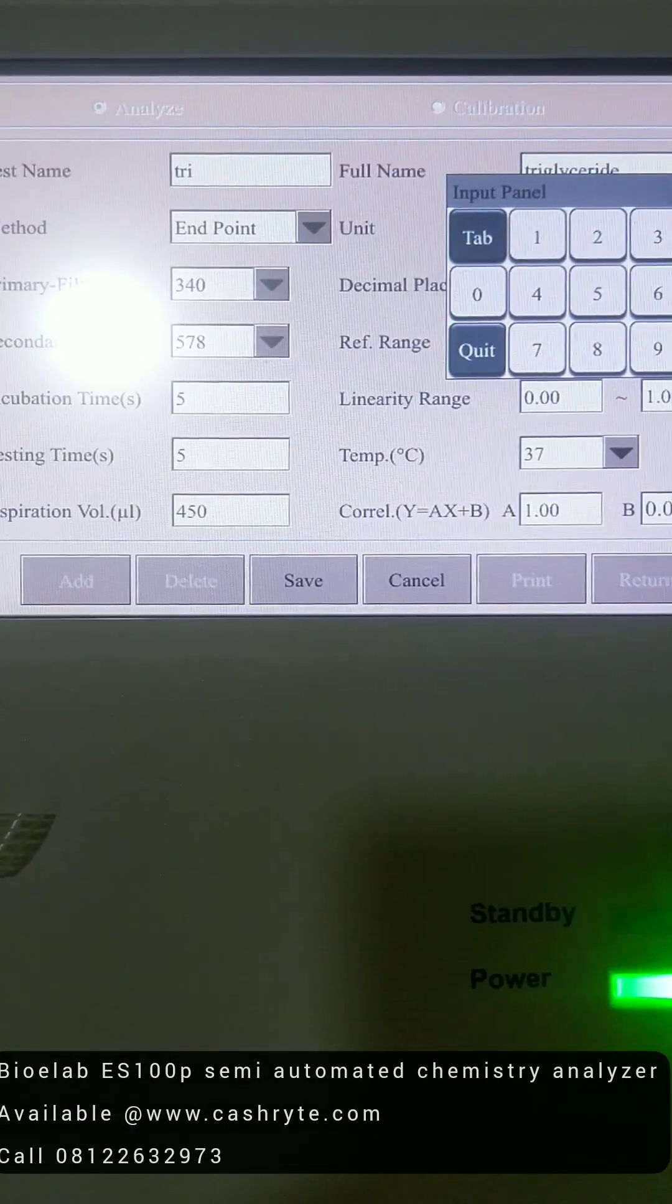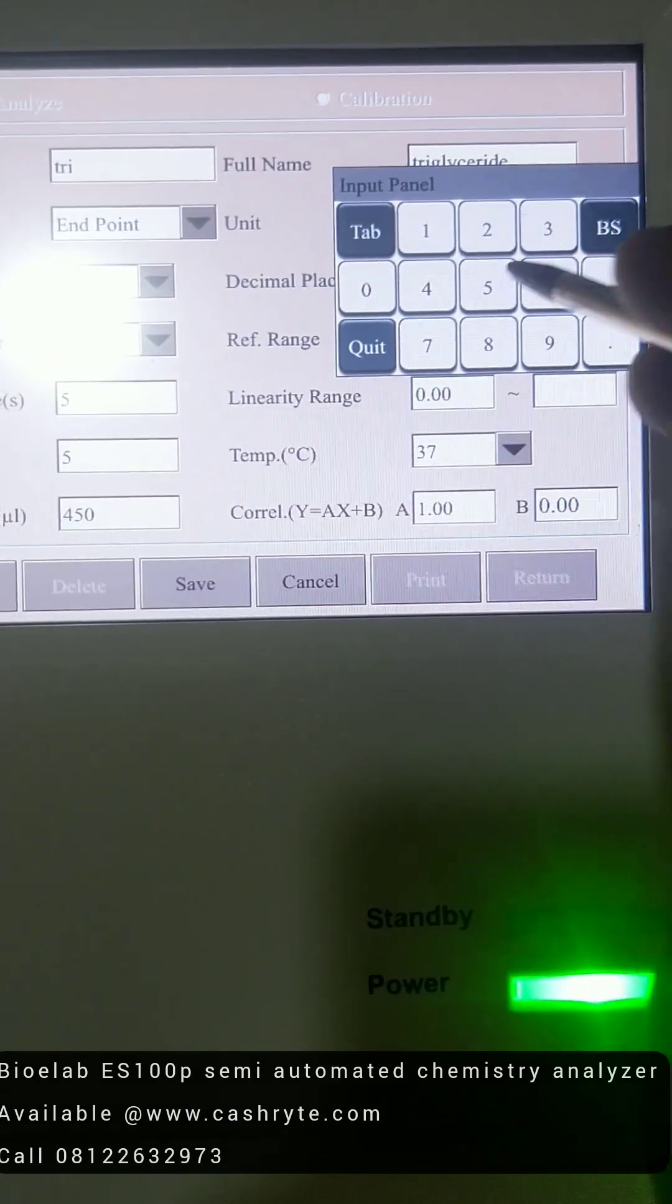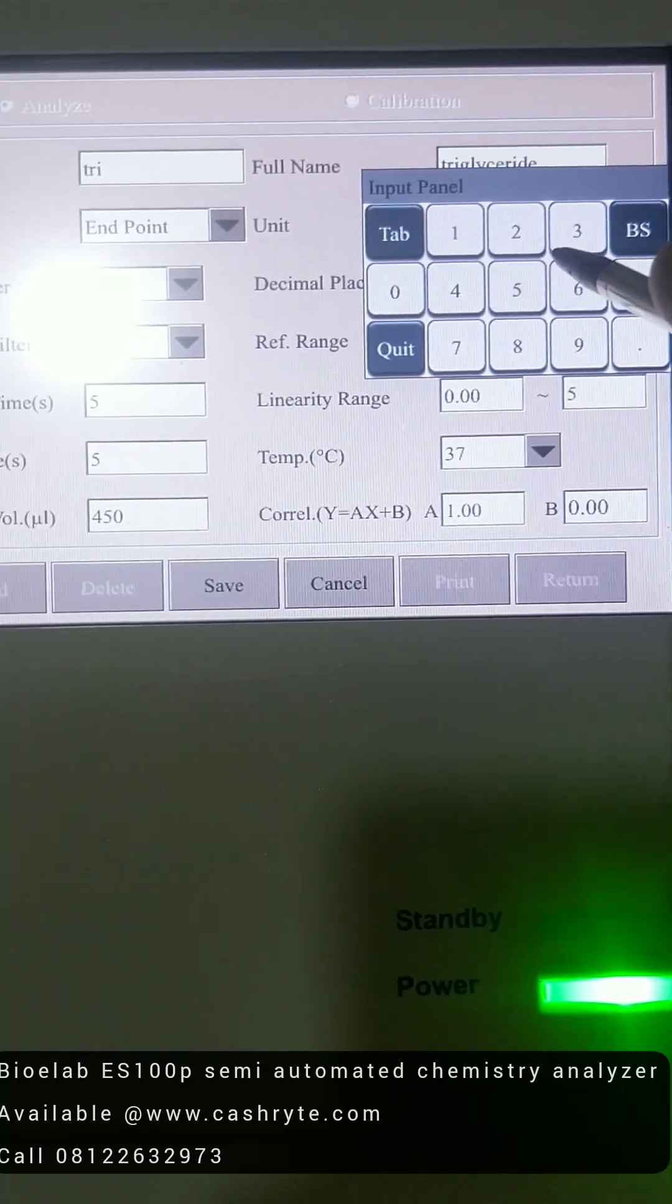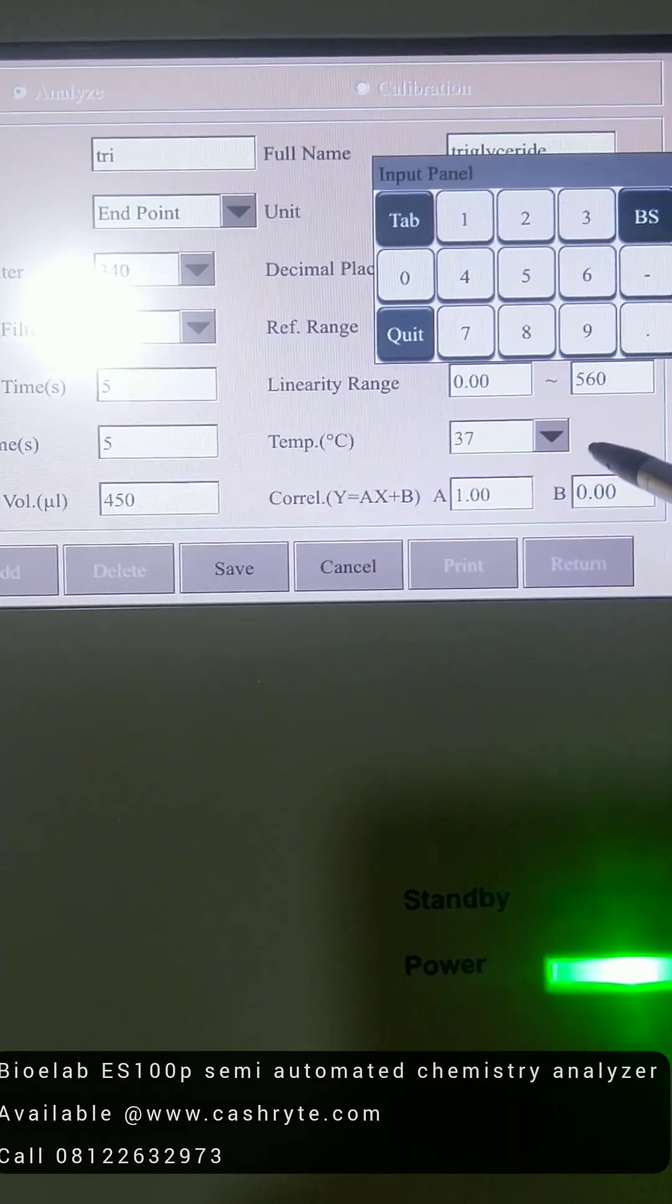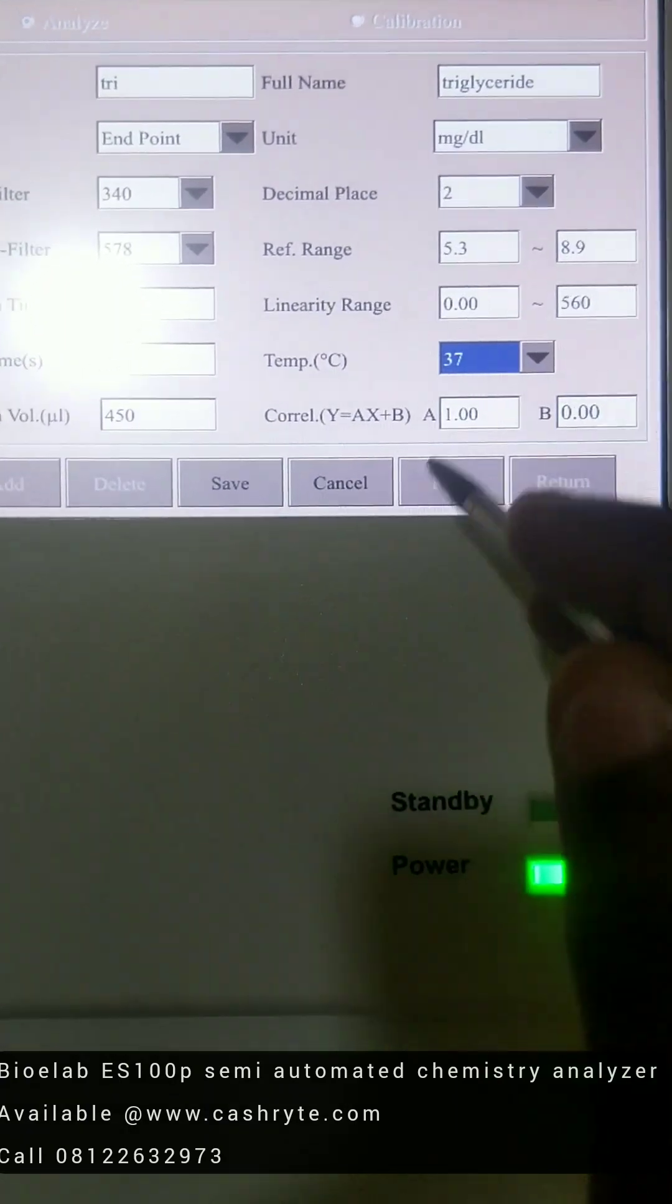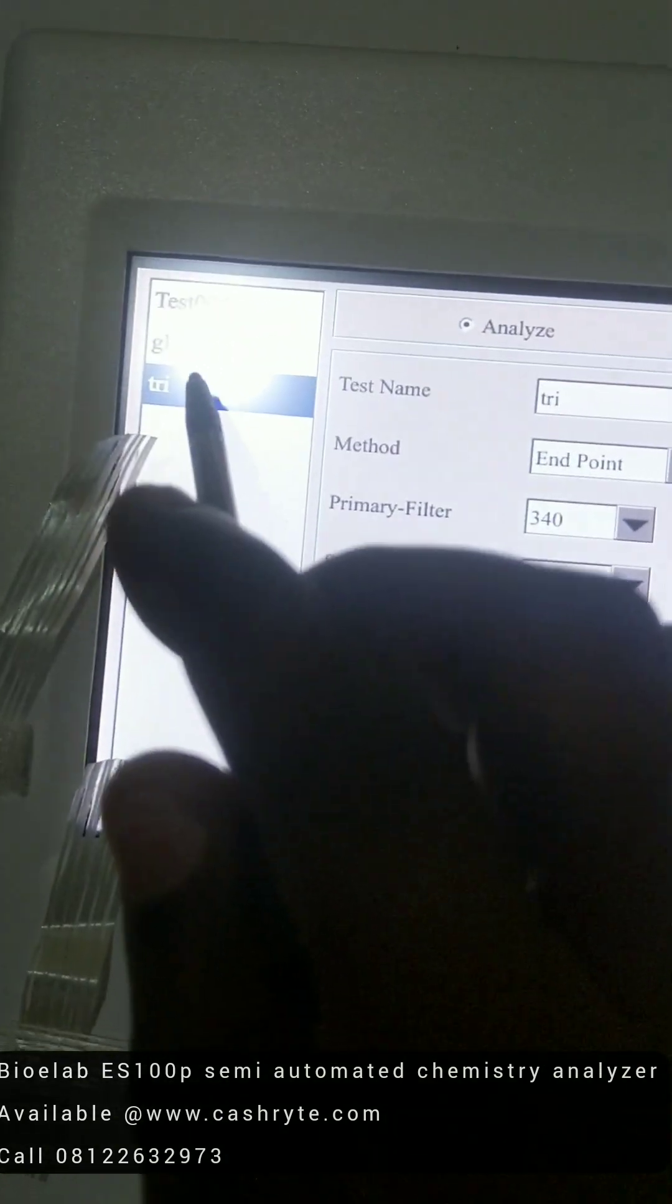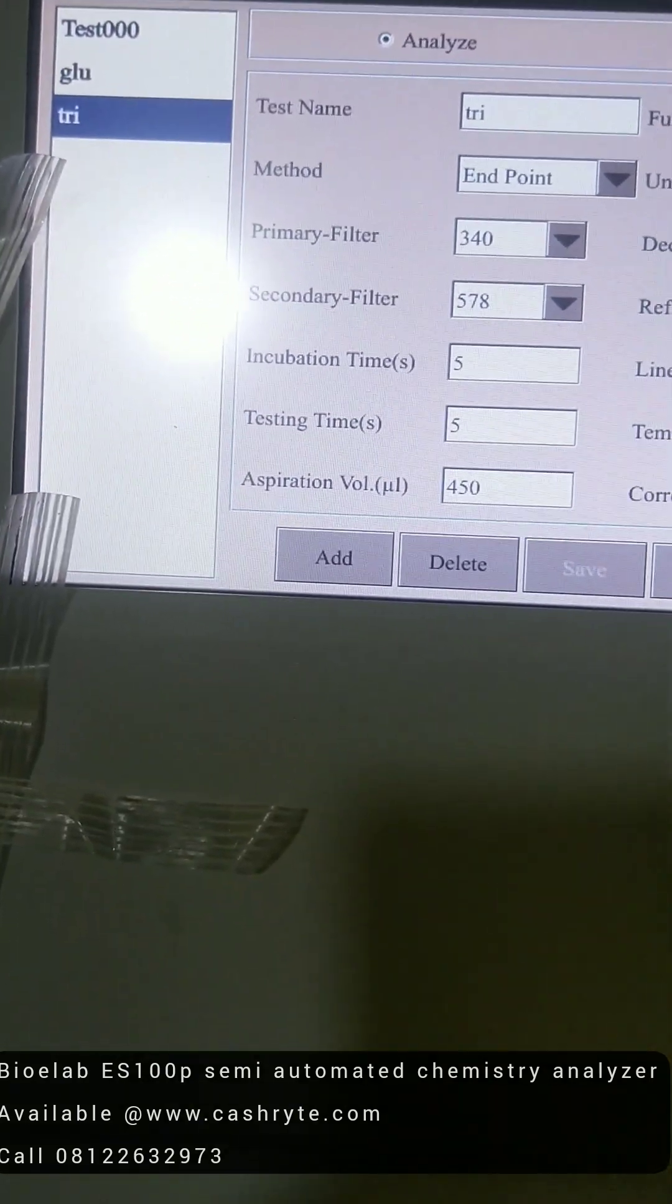It also depends on what your linearity will be on your manual. So let's just choose randomly, let's say 5.6 for the linearity. So you create, set the temperature, and that's all. You click on save. So you come here, now you see triglyceride is saved. It's one of the parameters we've already programmed.